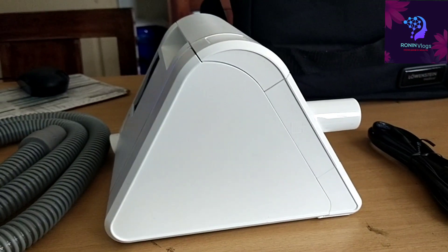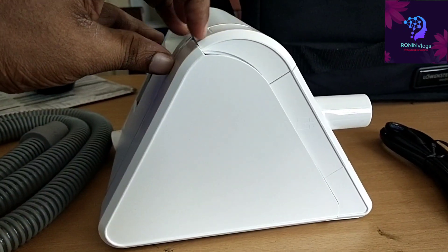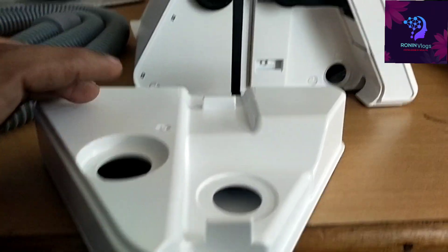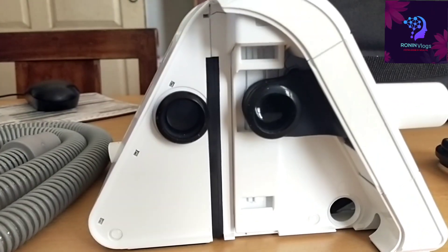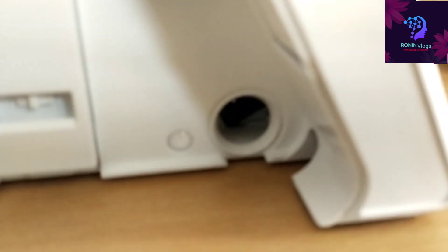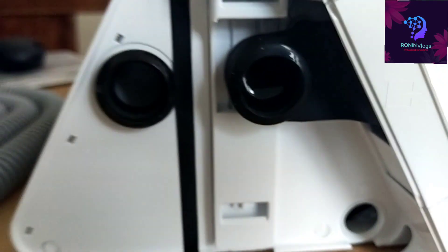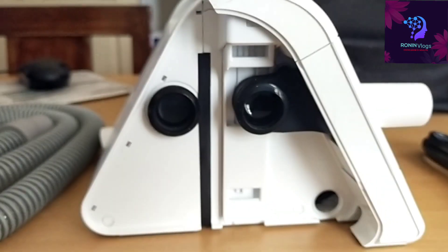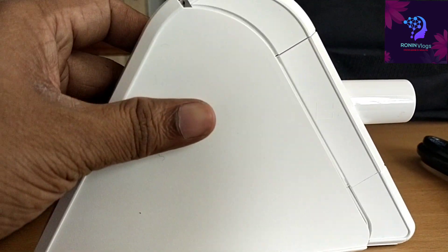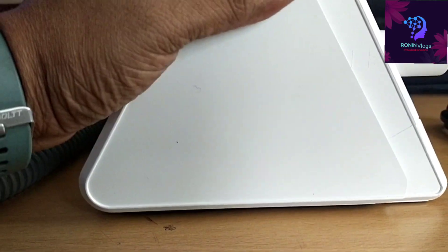To connect the humidifier, we need to press this button to unlock it, then just remove the panel. We need to connect the humidifier in this position — this is the place where the humidifier is going to connect. To put it back, just press and there is a lock; it will automatically lock.